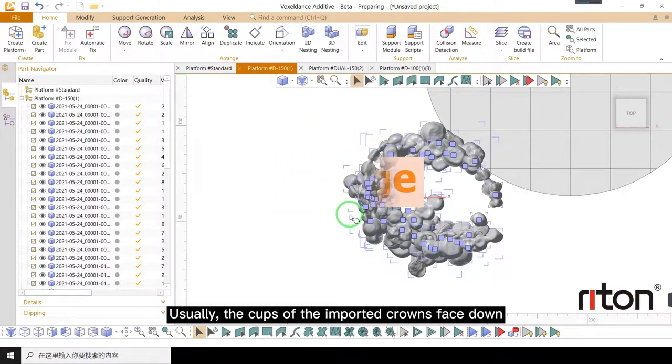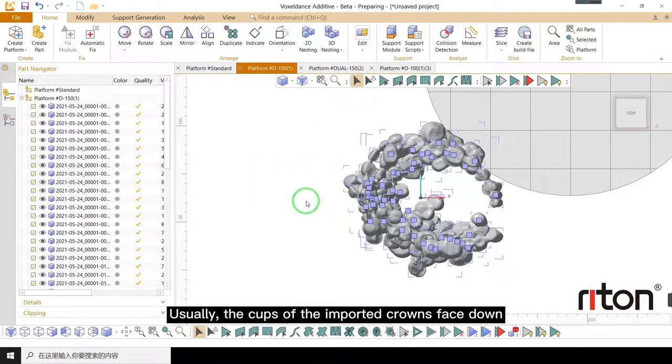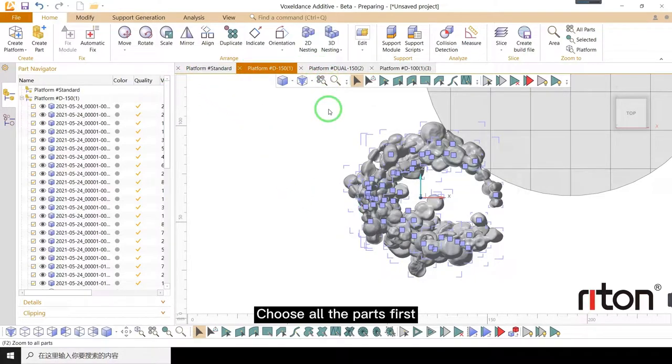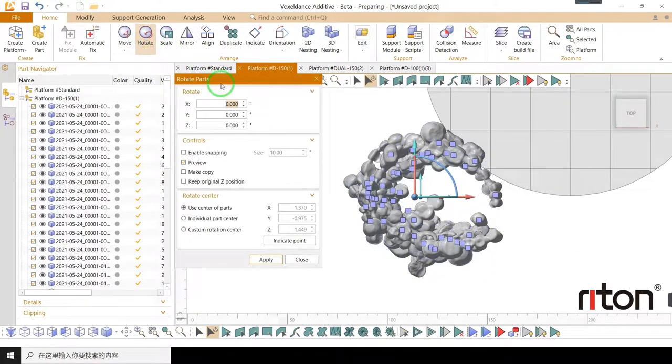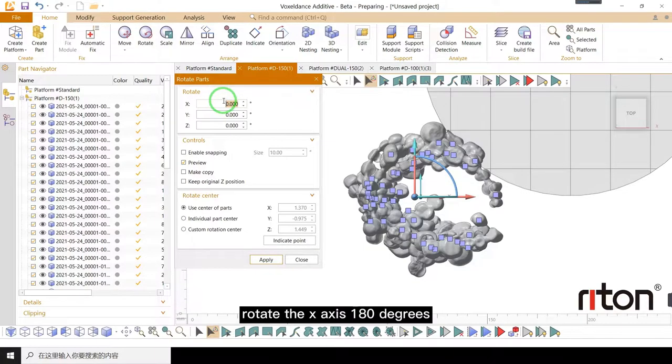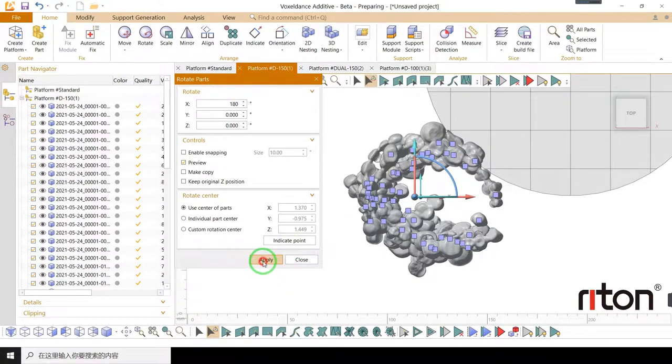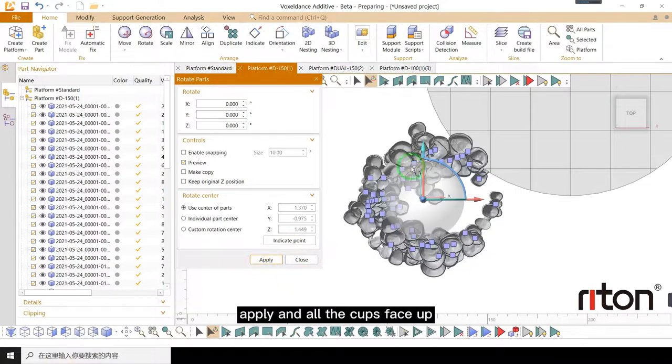Usually, the cups of the imported crowns face down. Choose all the parts first. Rotate the x-axis 180 degrees. Apply and all the cups face up.